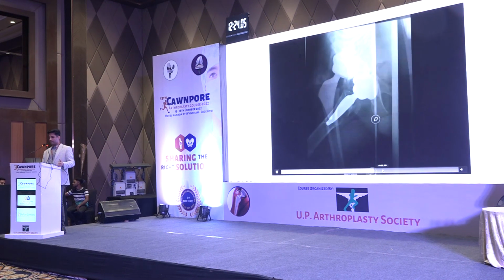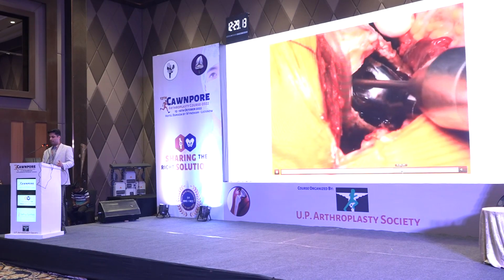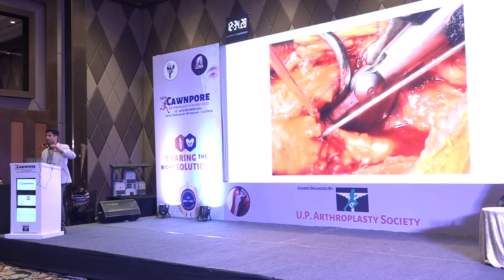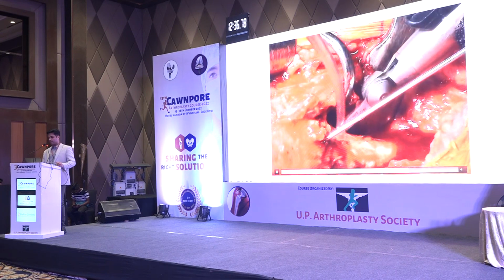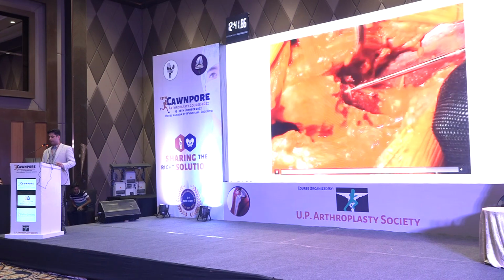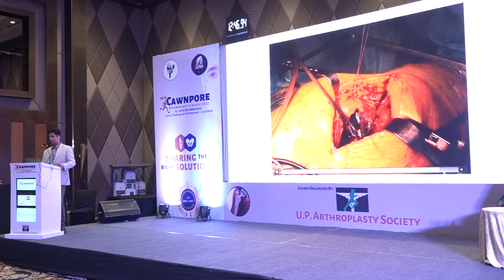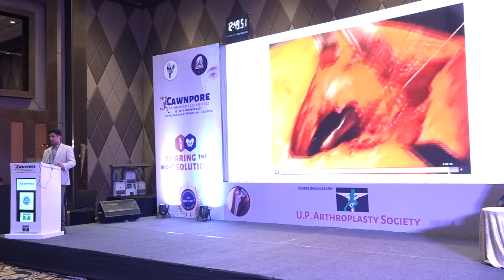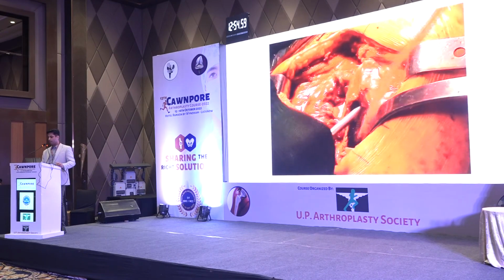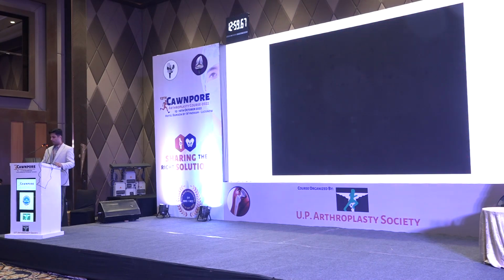However, if you have things like this, you have to go around it, and sometimes you've got to make a fenestration on the outer side, just below the greater trochanter, and punch it out from that side. So you can make that little window on the outer side, open it and clear it, and you can pass in your Gigli wire saw, loosen that prosthesis, and then just tap it out from the lateral side. Once it's loosened and cleared out, just tap it out and it comes out from the neck portion. But these are all difficult surgeries. They're going to take a lot of time. This is something you should be aware of.